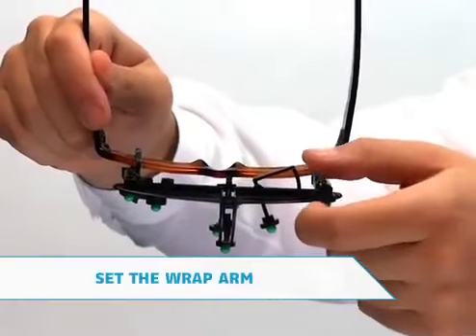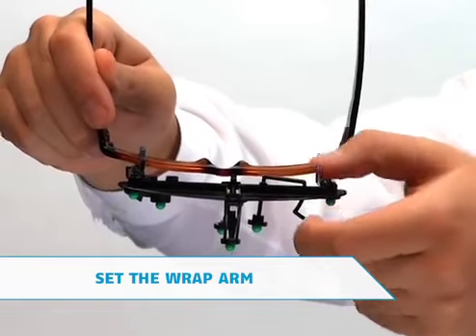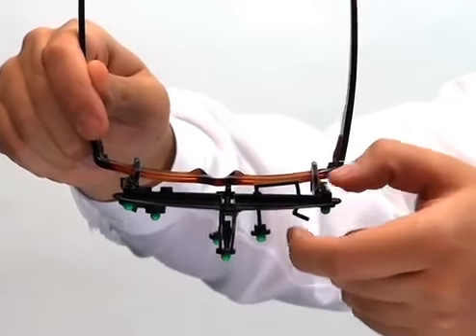Looking from above, push the wrap arm ledge back or forth until it's parallel with the curvature of the eyewear.